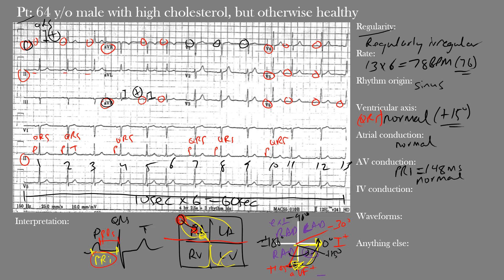Next is intraventricular or IV conduction, where we look at the duration of the QRS complexes. Normal QRS duration is between 80 and 110 milliseconds, or two to three small boxes. We're checking that the QRS interval is not prolonged. Here we can see narrow QRS complexes within normal limits — the QRS duration measured 82 milliseconds, which is within the 80–110 millisecond range. So IV conduction is normal with no intraventricular conduction delay. The QRS interval runs from the beginning to the end of the QRS complex.